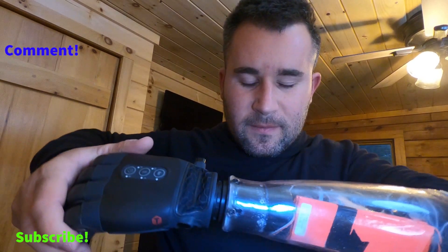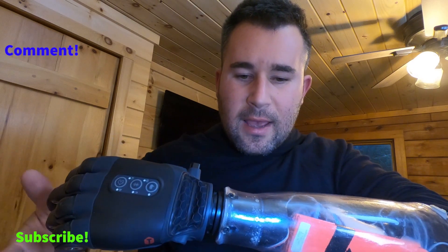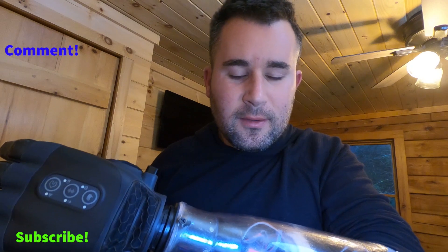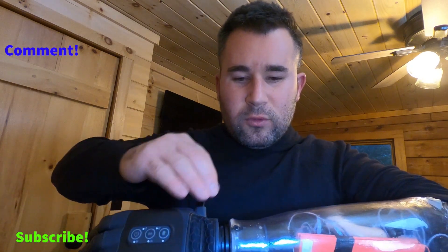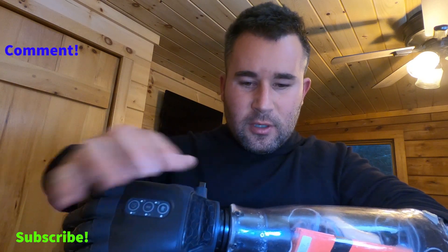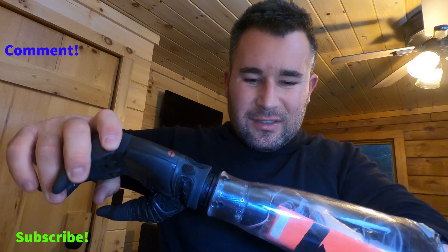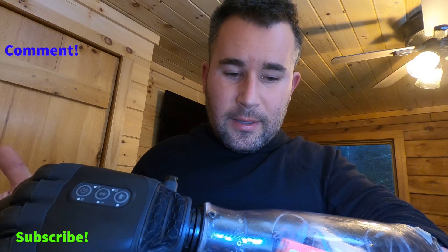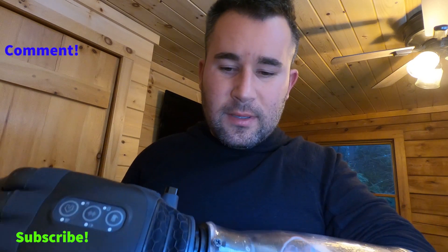I don't know if this is something they can do or not — I have to look into that. Tasca, if you're watching, maybe you can let me know. I would like this a lot firmer, a lot harder to rotate. It's just too easy. It's not a deal breaker, but I need it to rotate better.